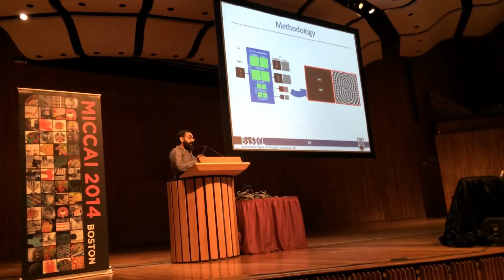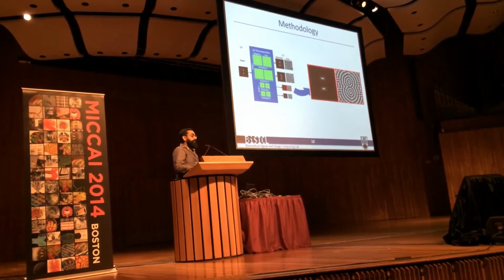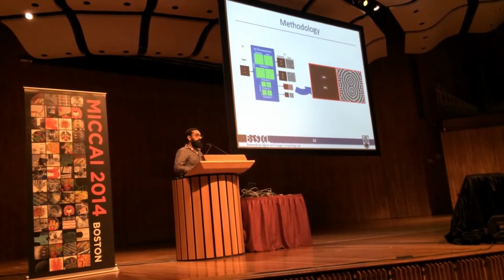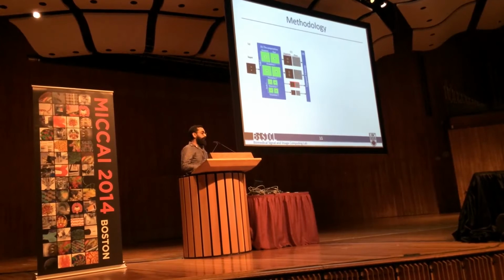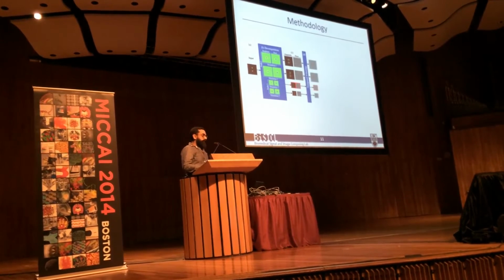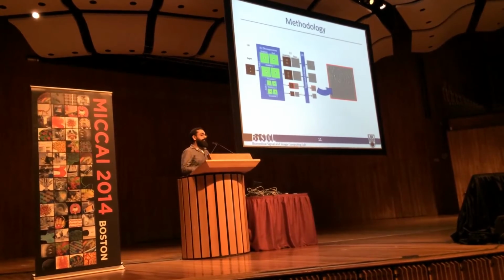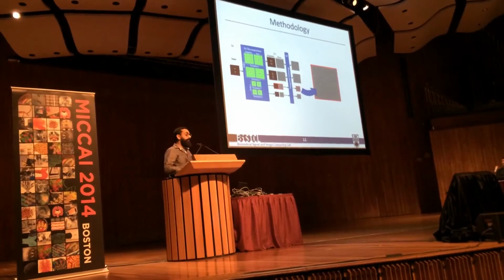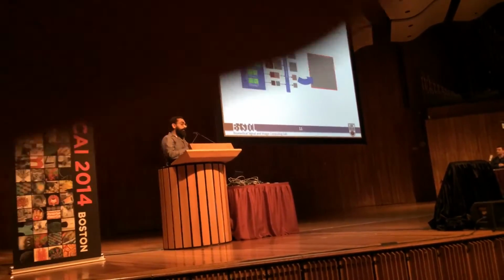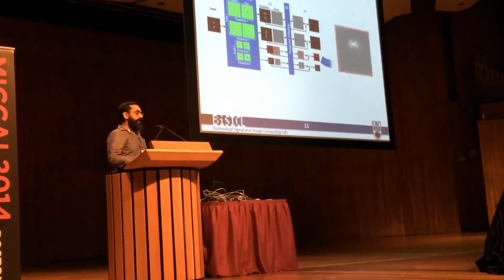And then, since I mentioned that motion is the change in local phase, we can measure this change by applying a simple temporal bandpass filter. This could be an ideal filter, for example. After applying this filter, we notice that there's change in phase in regions where there's no strong magnitude information. So to attenuate these regions, we just take the per pixel product of the magnitude with the bandpass phase information.